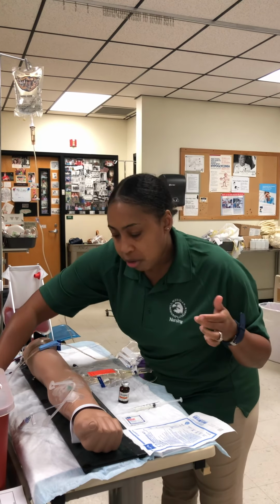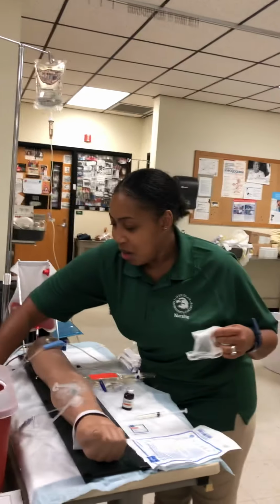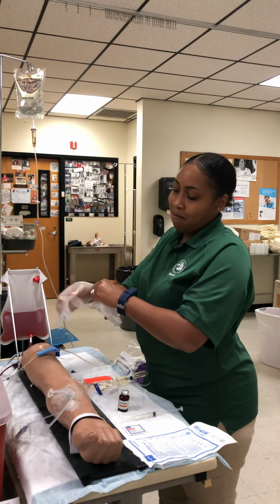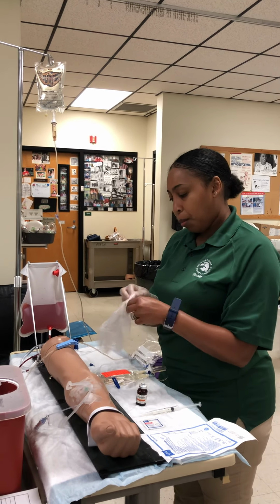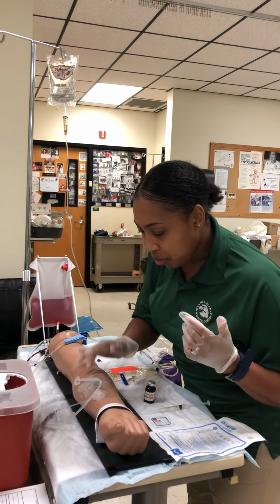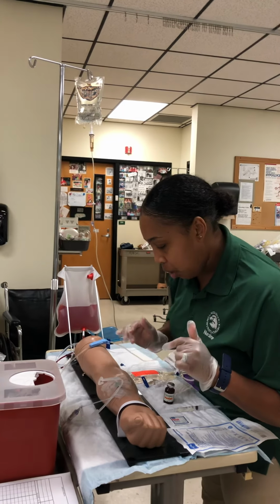I'm gonna put some more gloves on, and I'm gonna just palpate around your site. Okay. You have no redness, warmth, or tenderness, and if you feel any discomfort, let me know.